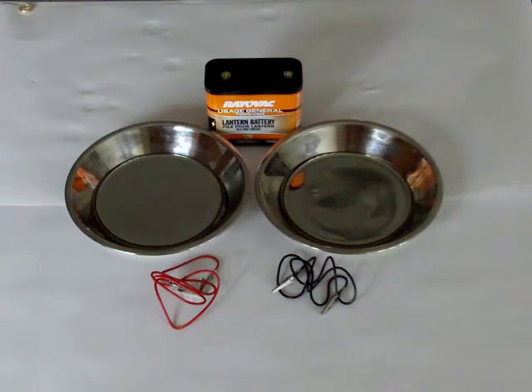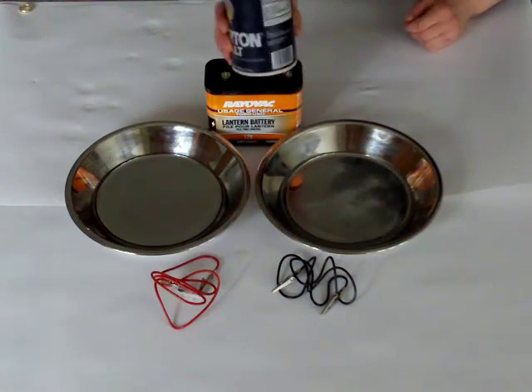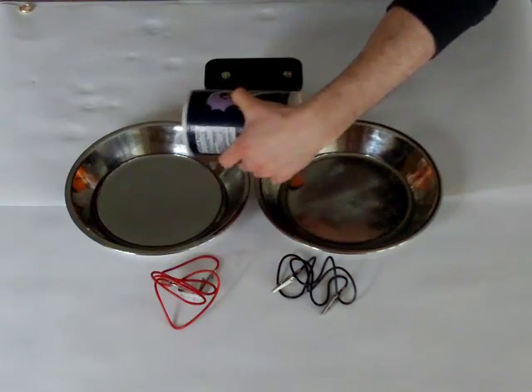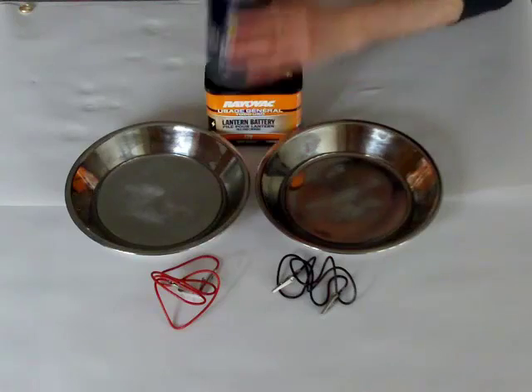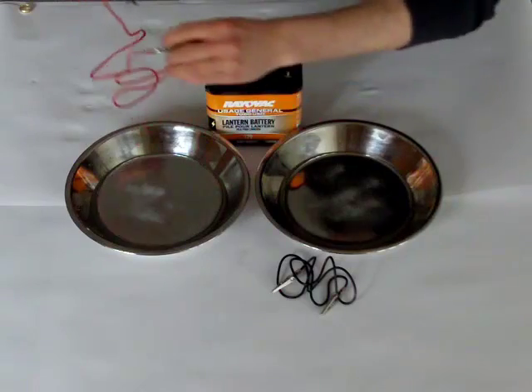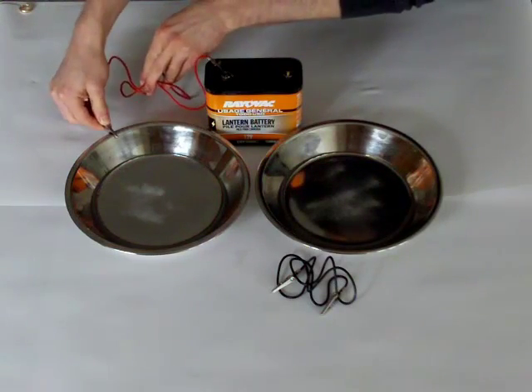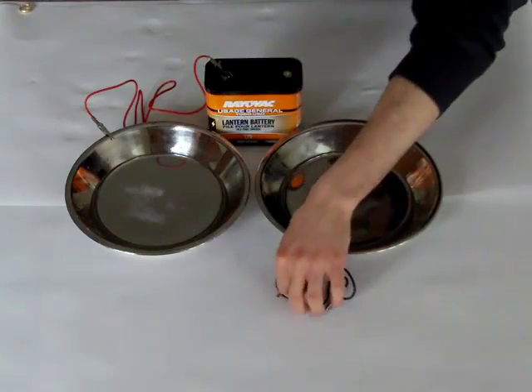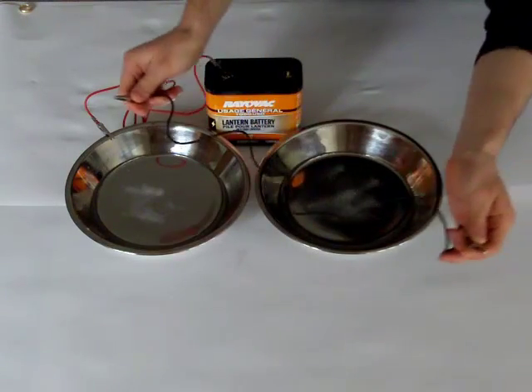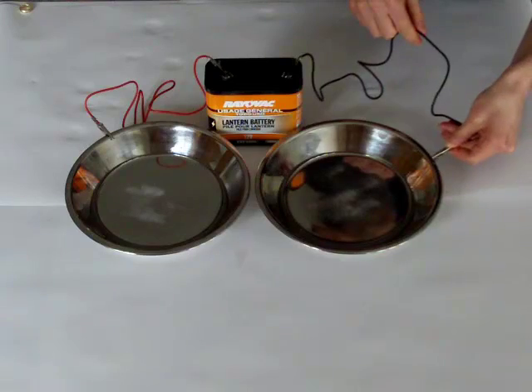Now I'm going to shake some salt into the pans. You don't want to start adding salt until you've done this about 4 or 5 times and you're confident with your results. There's really no exact way to do this — just give it a quick shake and try to spread the salt evenly. Next, attach one of the alligator clips to the battery and the other side to one of your pans. It doesn't matter which charge you start with. I like to use red for the positive charge. Never connect both alligator clips to the same plate while connected to the battery — that's a fast way to destroy your battery.